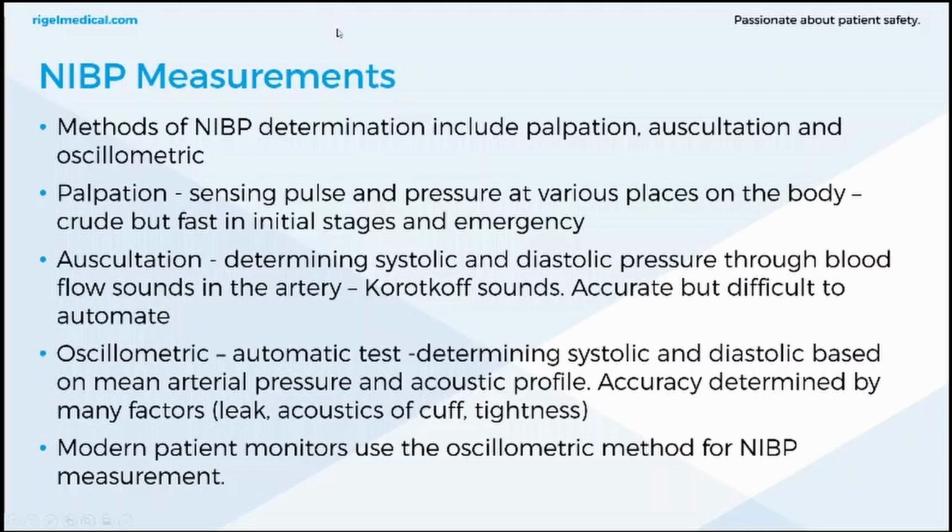They're not without risk. There's risk from infection, you've actually got to put a catheter directly into the arteries. So it's not ideal if you just want to perform a quick, simple procedure, which can be done by both skilled and unskilled people. So that's why NIBP is used very commonly. It's not as accurate, but it's got its advantages.